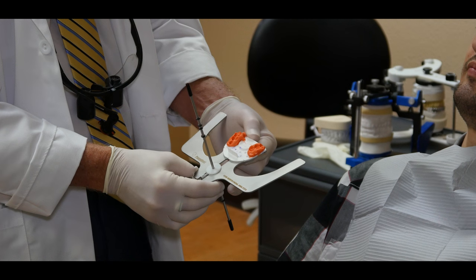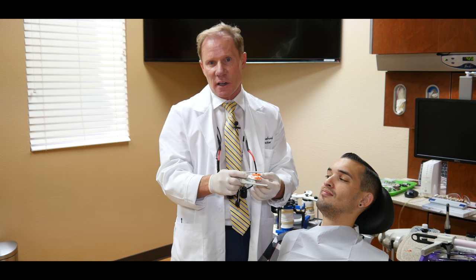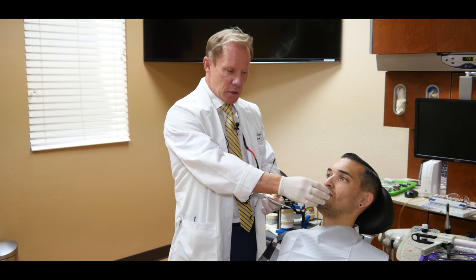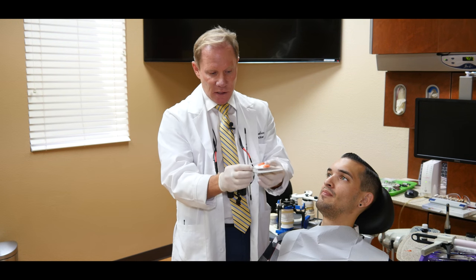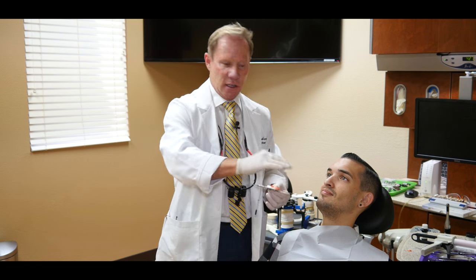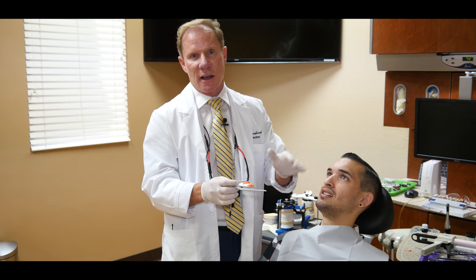And you can see basically this is what this looks like. Now at this point, I like to take a photograph of this to send to the laboratory. Sometimes the laboratory, after they pour up the model, realizes the patient has a severe maxillary cant, and with the earbow or the earless facebow in place, the cant makes the models look skewed on the articulator. So I like for the ceramist or the diagnostic waxer to be able to look at this photo and see that this truly is the plane, both the esthetic and functional plane, and that he did have that posterior cant.